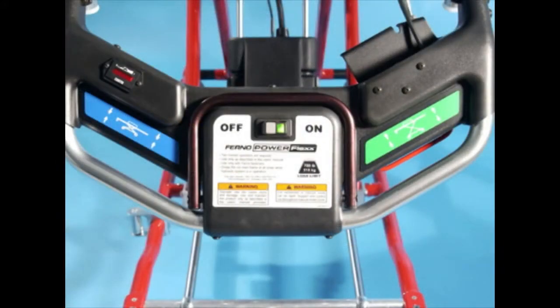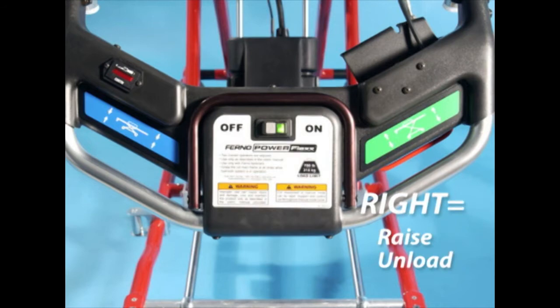Use the following memory aid to remember the touch pad functions: Left equals lower or load. Right equals raise or unload.